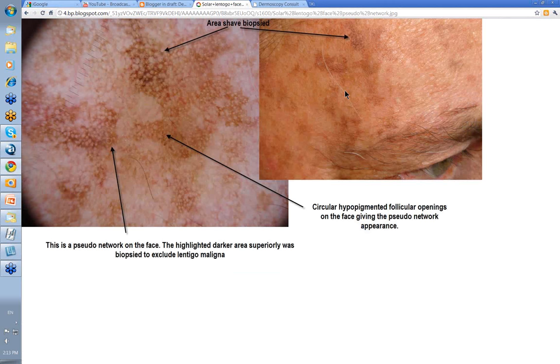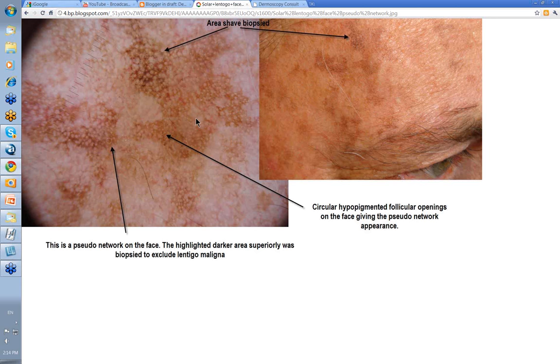Then we come to an area on the face, and this is where it becomes more difficult. Look at this amount of sun damage on this chap's face. There's this lesion here — this bit and this bit out here too. It was the darker bit that caught the eye. When you put the dermatoscope on it, you've got areas of darker perifollicular pigmentation. These circular hypopigmented follicular openings on the face give the pseudo-network appearance. Early lentigo maligna gives you pigmentation around these follicular openings, and that was the concern. This was shaved, but again it was a simple solar lentigo.